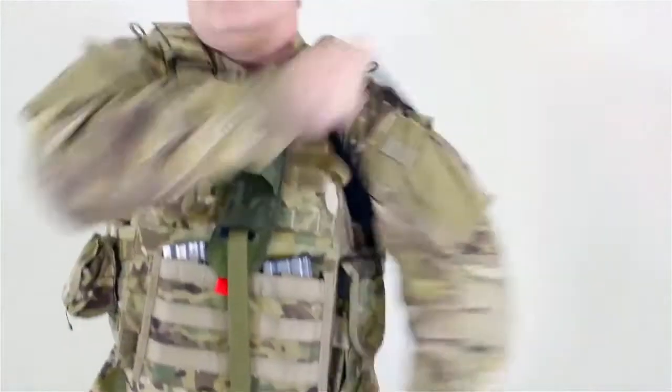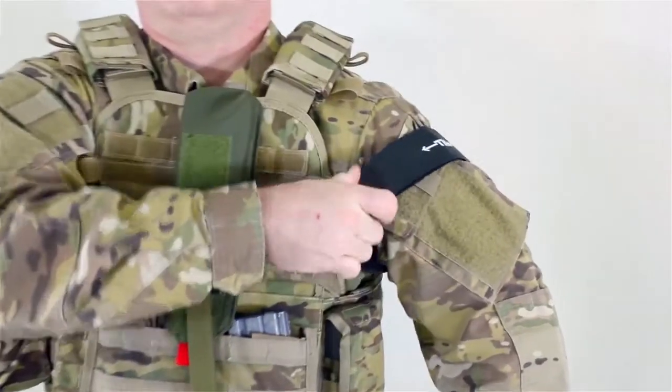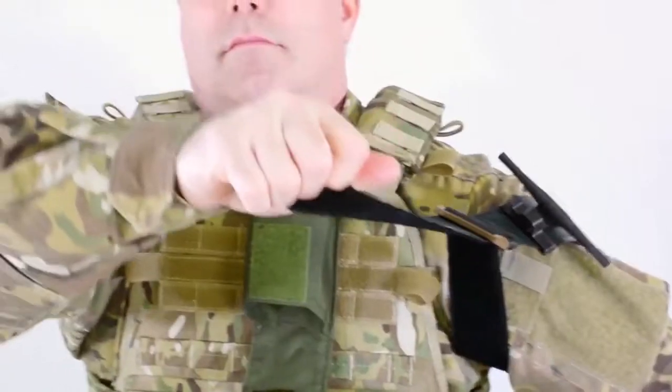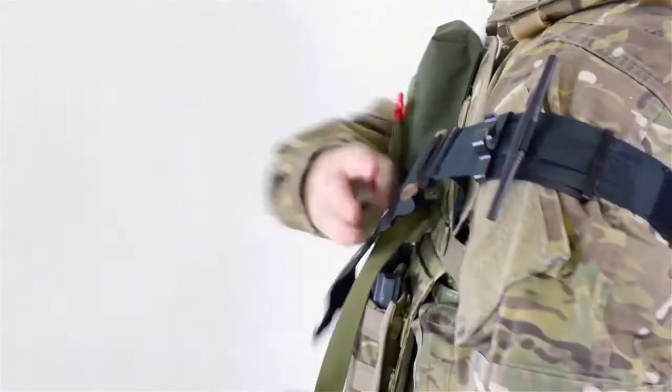place around the injured extremity high and tight above the wound. Pull the time tab until the velcro tail is separated from the TMT. Grip the tail close to the buckle.